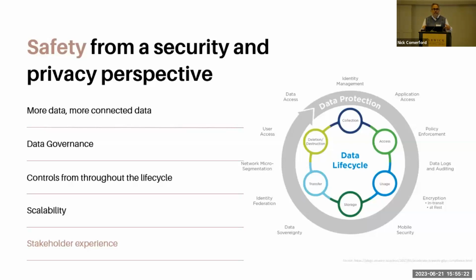You do security monitoring, you have to have dashboards looking at access control, dashboards that look at the life cycle of what happened with that patient data, because the regulations require someone at the management level to review that data periodically. So all of a sudden, to make that data usable, it gets back to you needing a human factors engineer.